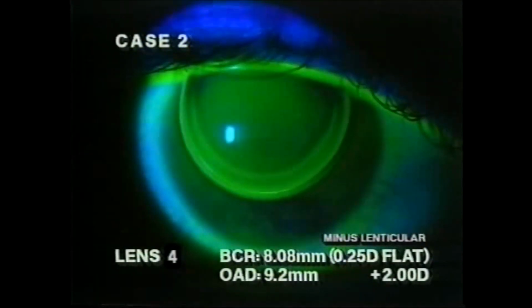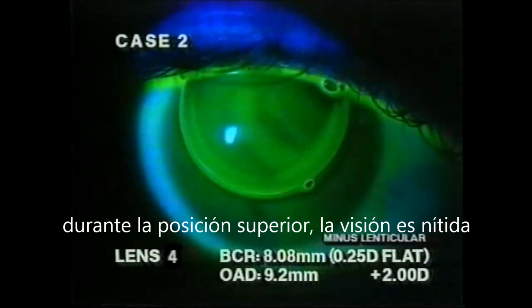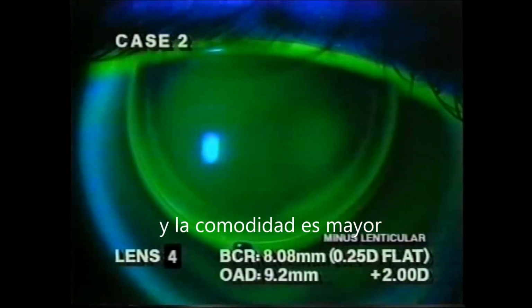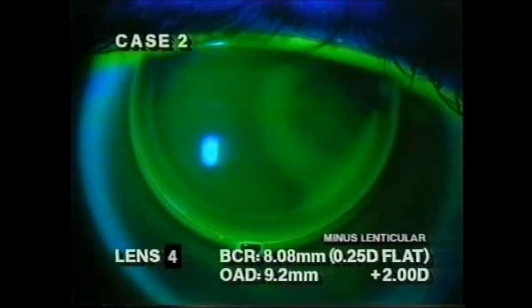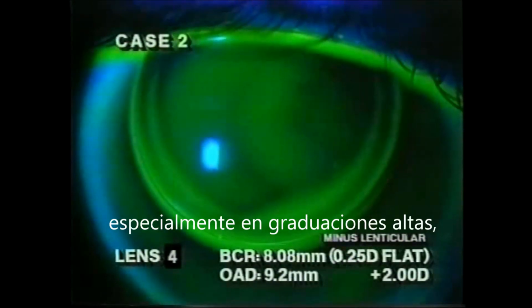The pattern is diffuse and uniform, characteristic of an alignment fit. Due to the superior positioning of the lens, edge clearance is greater inferiorly. The use of a minus lenticular has resulted in a much improved lens to cornea fitting relationship.